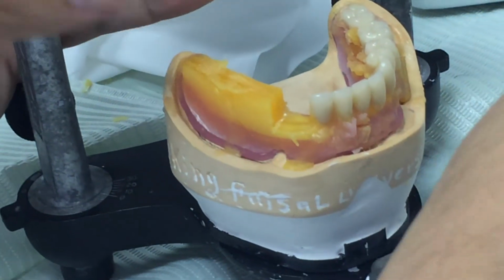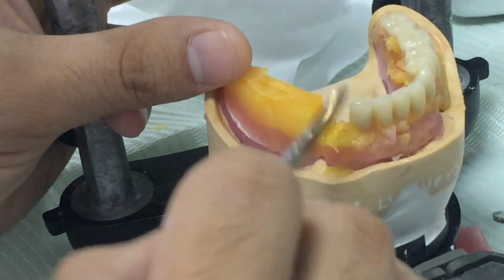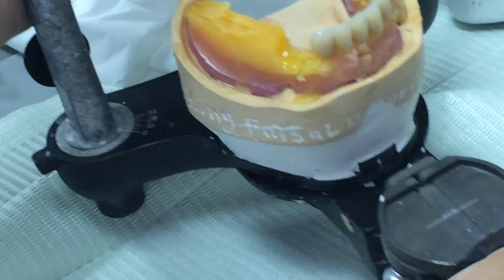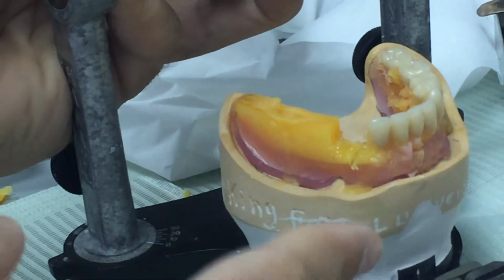So the wax rim now is my guide also for the crest, for the teeth, to do a teeth set, right? So now we got the relation which is there underneath.